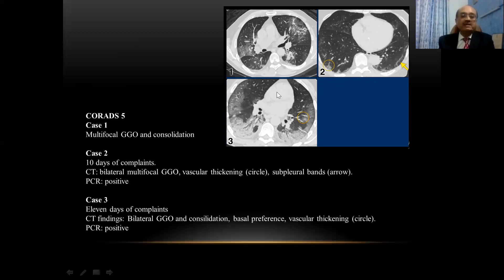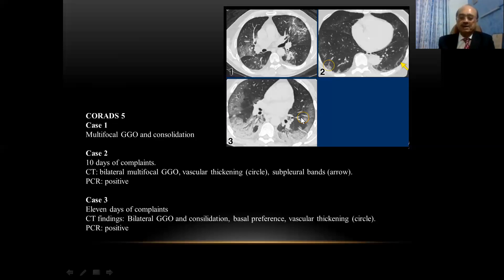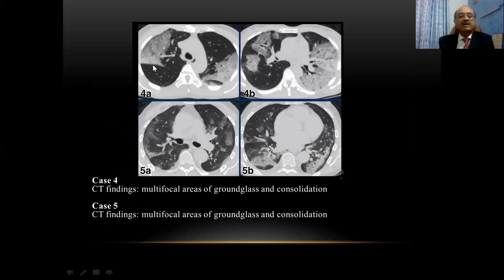As the disease progresses, a CT on day eleven showed extensive bilateral typical subpleural ground glass opacities and consolidation with predominant basal prevalence, and very classically seen vascular thickening. This patient also had a positive PCR. So bilateral basal subpleural ground glass opacities with vascular thickening, in conjunction with relevant history, is almost certainly COVID-19, confirmable with a positive PCR. Additional CORADS 5 cases show multiple areas of extensive ground glass opacities and consolidation, confirming the diagnosis of COVID-19.